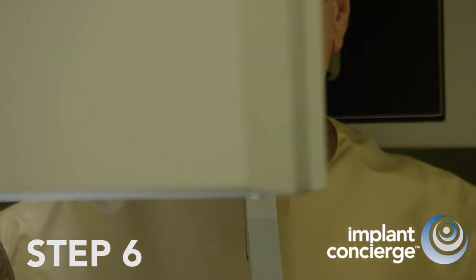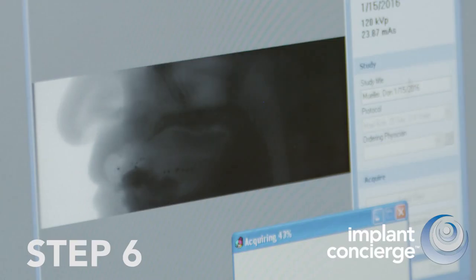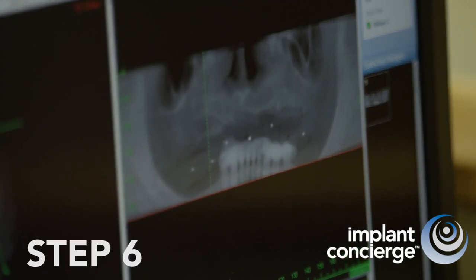Before releasing the patient, ensure that there are no black spaces between the denture and the soft tissue on the scan. It is critical to have an intimate fit if you want a stable and accurate surgical guide.